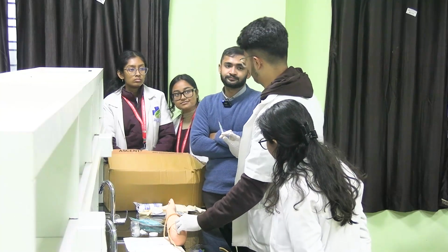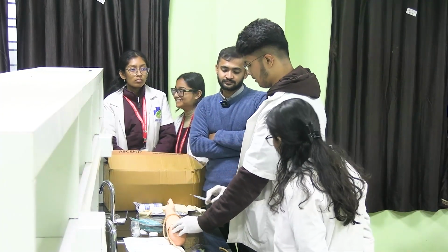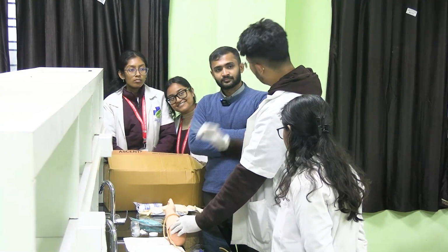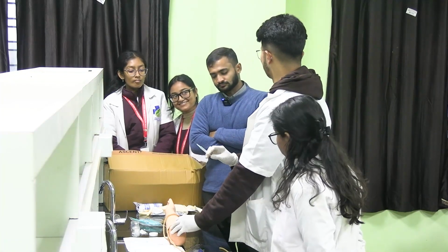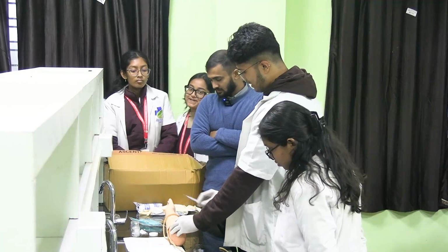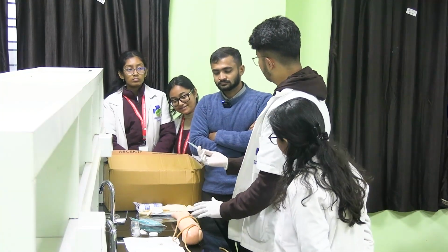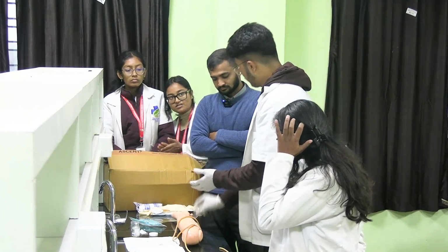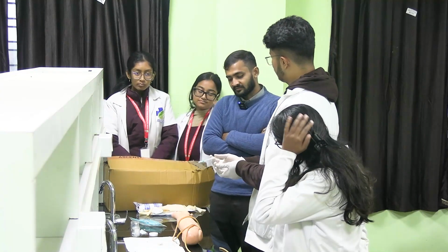Then, sir, I'll discard the needles. I'll wait, sir, for 1 minute. And after 1 minute, sir, I'll observe the patient for 15 minutes to see if there's any reaction, sir. And then I will counsel the patient, sir. Reassure the patient. Then I will remove my gloves and then hand wash, the last step. Okay.